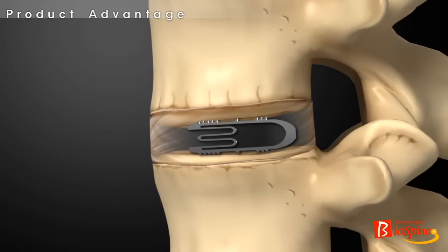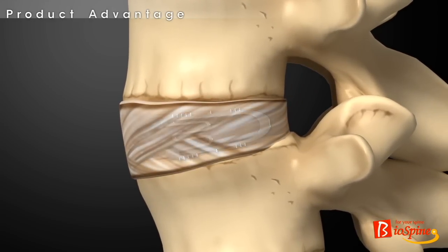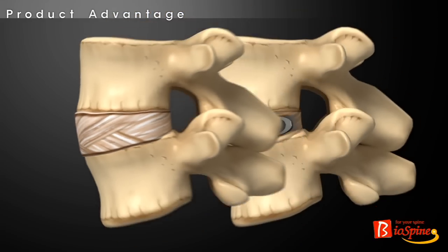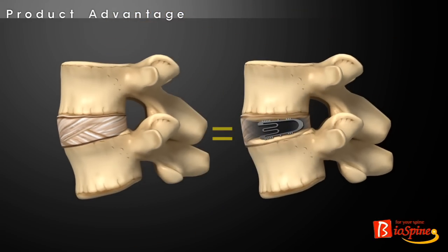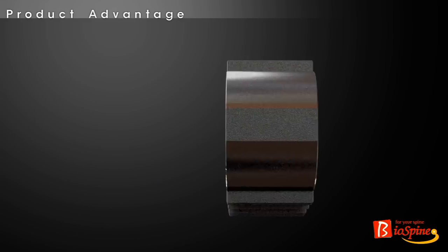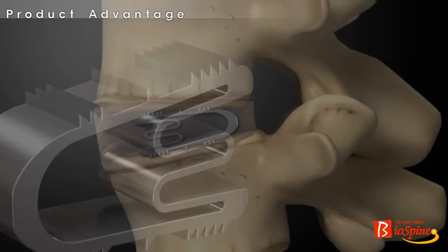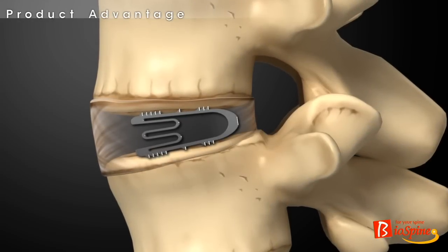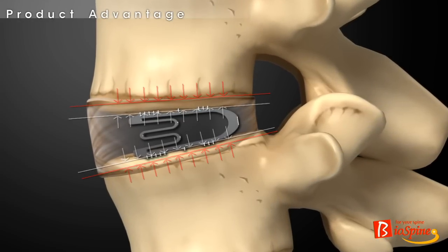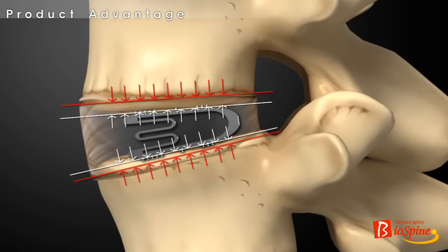However, the flexible cage system has an elastic modulus, very similar to that of normal intervertebral disc and end plate of vertebral body, compared to traditional cages. That is, thanks to superelasticity of nitinol and shock absorption effect of plate spring, the flexible cage system can minimize reaction force applied to end plate of vertebral body, which originates from axial compression load applied to cage.